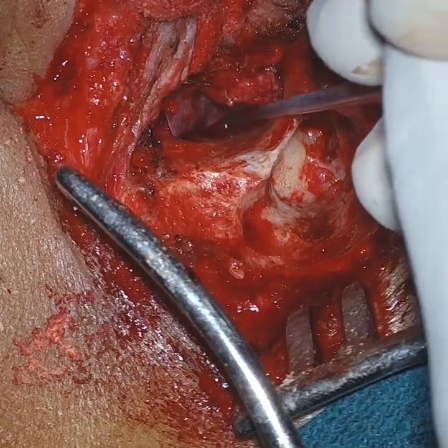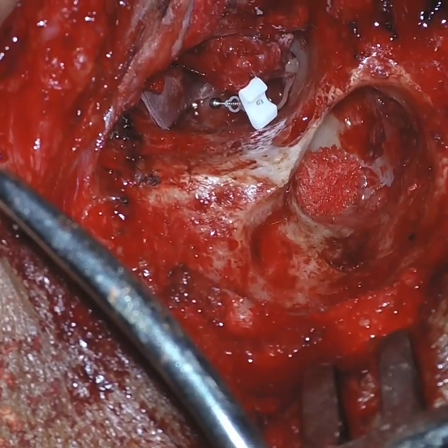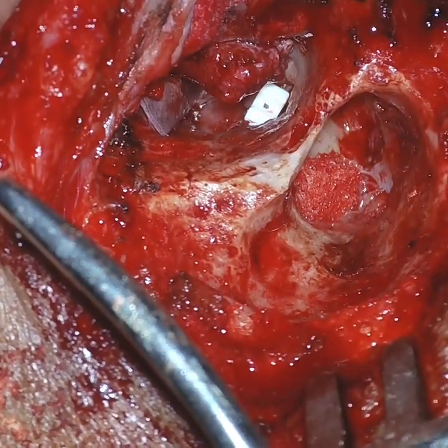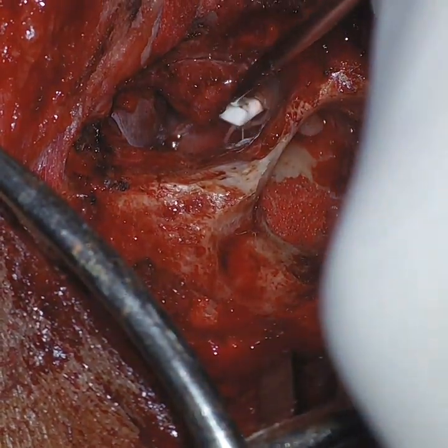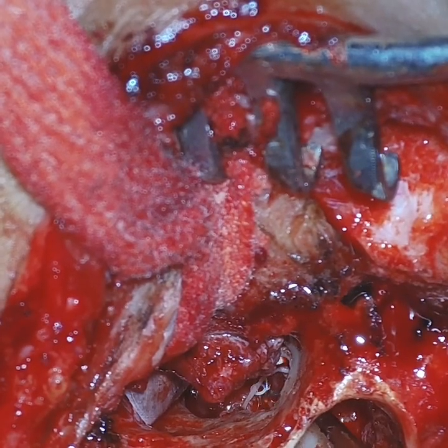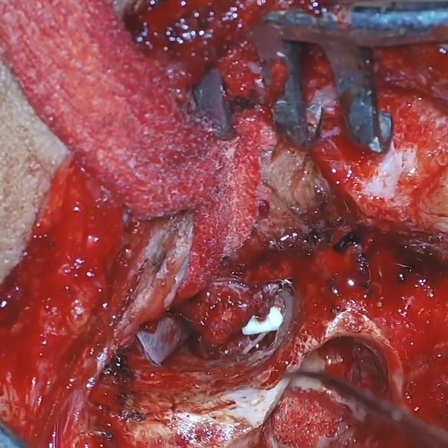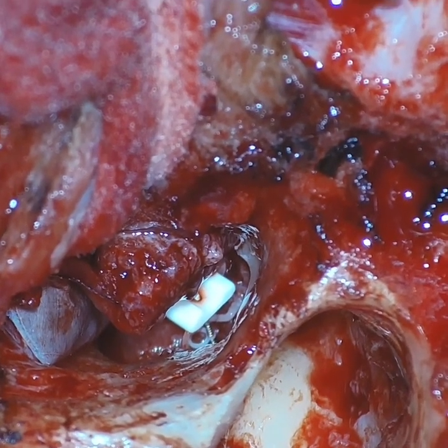So here we have grafted the central perforation, and now we are placing the TORP. So it is a TORP with Teflon with the fluoroplastic head. So our aim is to follow the principles of ossiculoplasty. The most important principle of ossiculoplasty is that the angle should be very erect and the stability should be good, and it should lie away from the outer attic wall. So this is the position.